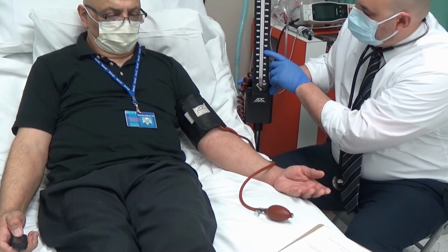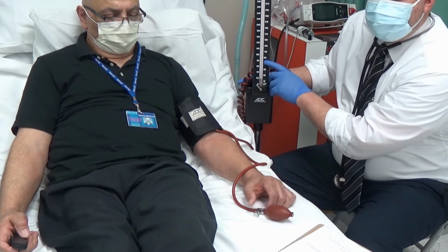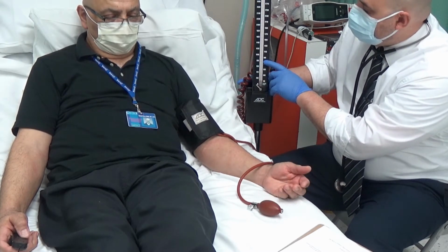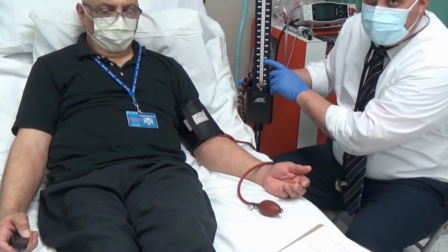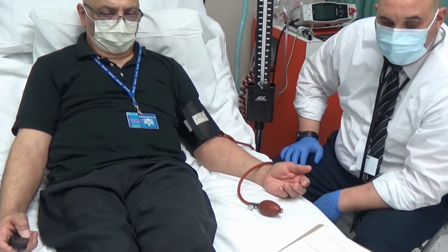Now the beat's going to continue as I'm slowly releasing the balloon pressure. Once that beat goes away, that is essentially your diastolic pressure, and I heard that right around 80, 82, okay? So that was his systolic and diastolic. He's probably about 128 over 82. Normal is 120 over 80. Very healthy individual. So that's how you would essentially get a manual blood pressure.